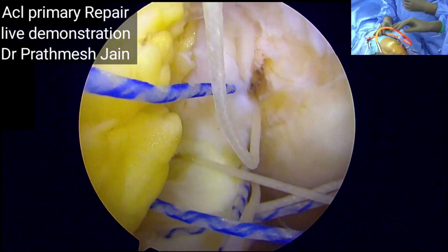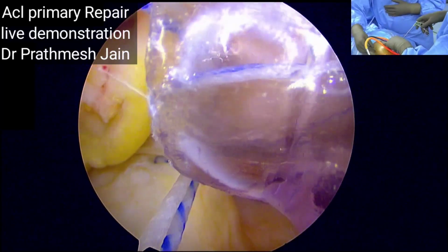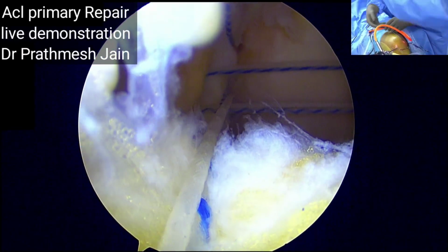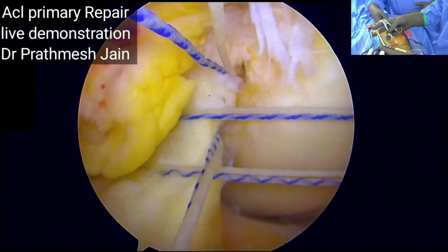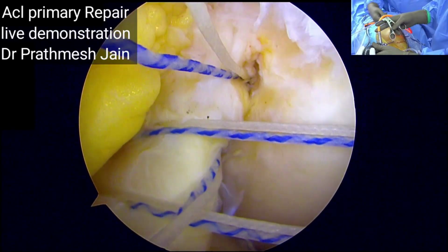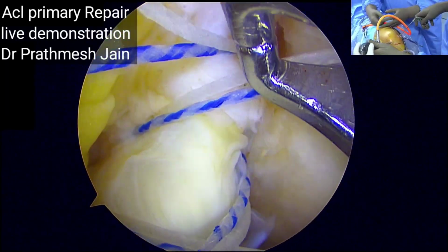So that my 2 anchors are in position. I have passed 1 suture limb from each and every suture anchor onto its place, and now I will be starting to tie my suture limbs. So you can see that these are the 2 suture limbs from the inferior anchor, these are the 2 suture limbs from the superior anchor, these are the 2 suture limbs from the superior anchor, these are the 2 suture limbs from the inferior anchor. So there are a total of 8 suture limbs, 1, 2, 3, 4, 5, 6, 7 and 8.